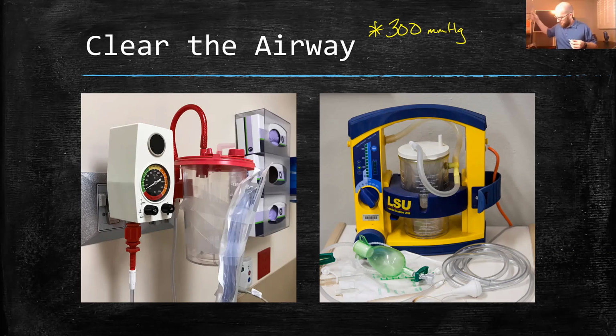When you have your suction tubing, just plug them right on there. But we have these flexible suction catheters that are a little bit thinner, and they'll have some sort of port there for you to cover up. What we have to remember is all of our different suction tips have a little port for us to cover. And once we cover that up, that's when the suction will start out the end.